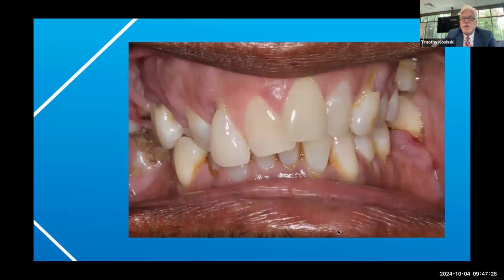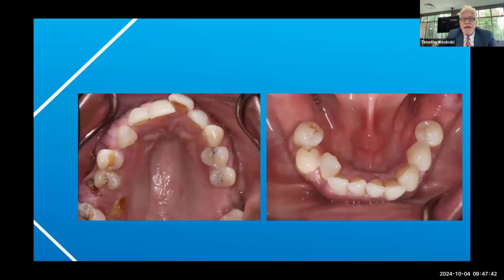Guided implant surgery obviously is all the rage today. And this is a gentleman, he was the manager of a car dealership when I bought my new truck. And what do you do, Doc? I'm a dentist. God, I hate my smile. I hate my teeth. And he's in the public eye all the time. Getting ready for a pretty major surgery. Going to give you a new smile.